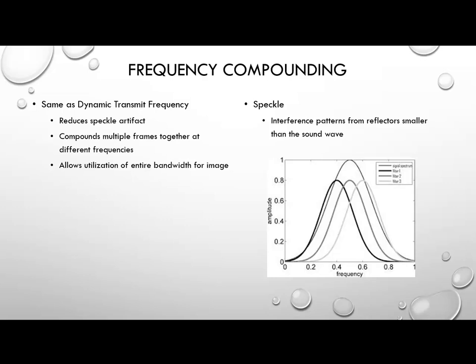Frequency compounding is the same as dynamic transmit frequency. This is a method to reduce the speckle artifact.